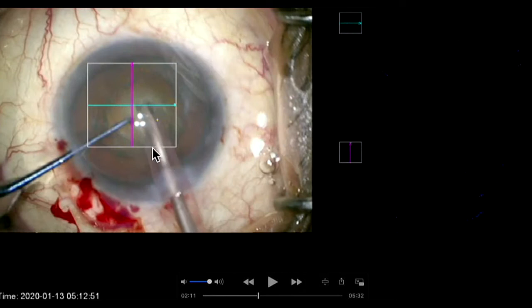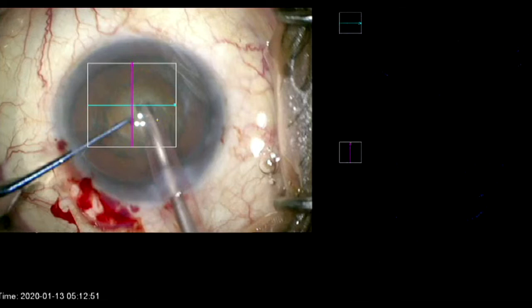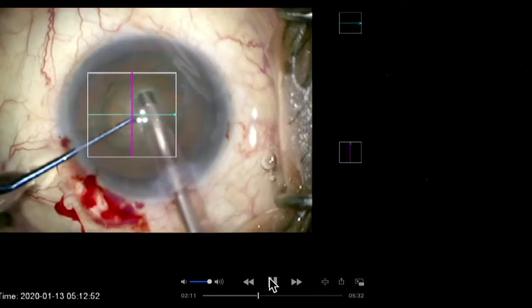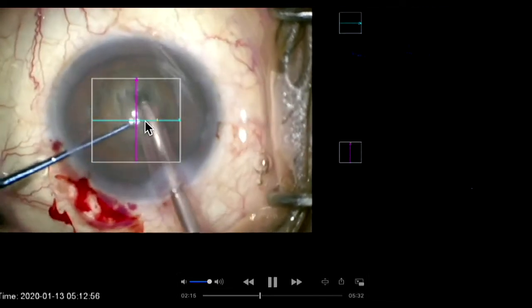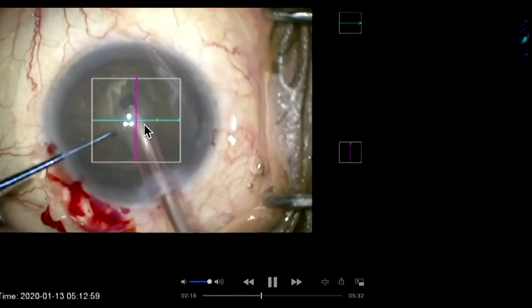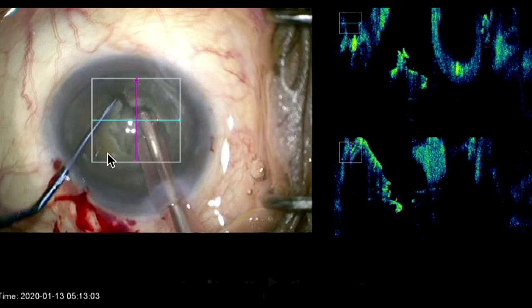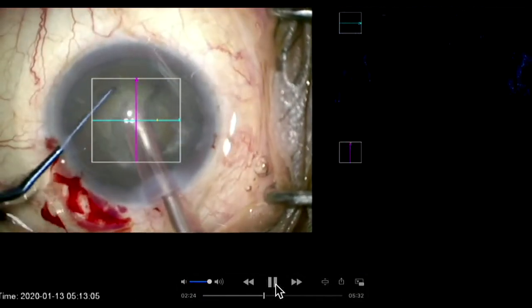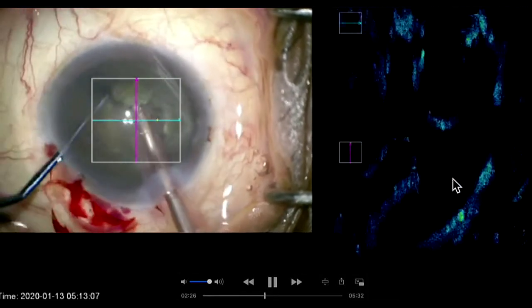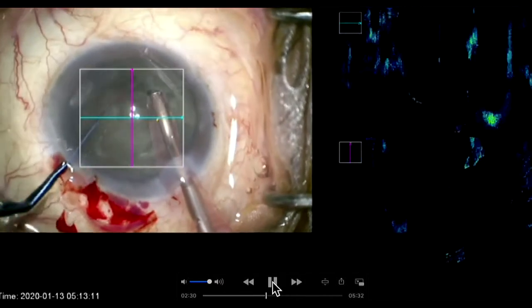For beginners doing phaco, we run the phaco while going in but not while coming out, and make a little trench so you can judge the hardness of the nucleus and go a little deeper for holding and chopping subsequently. This is the stop-and-chop technique. You can see I'll make a small trench area — this tells me how hard the nucleus is, and I can adjust my phaco parameters accordingly. Once I have that, I hold it and chop — vertical chop and horizontal separation with a little rotation towards my side. Once separated, you rotate so the piece has more area to separate. You can see my trench was quite deep enough to allow easy chopping with complete separation.